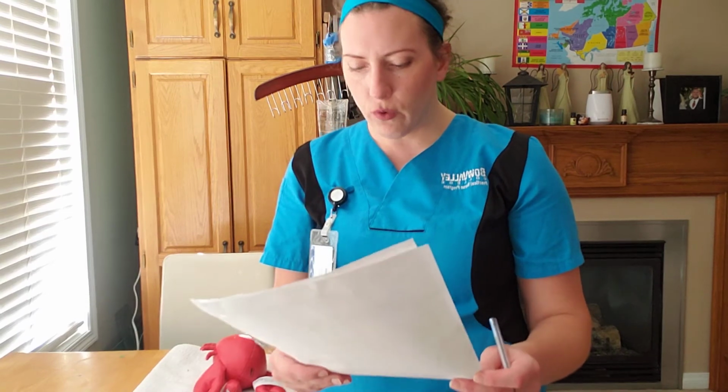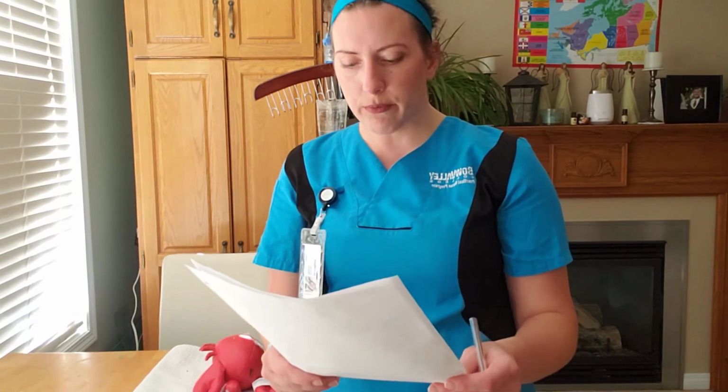So we're going to be looking for fluid to infuse, as well to dilute the medication in that fluid. We are looking for compatible in normal saline. So dilution for IV infusion is normal saline. This medication is available in a 25 milligram per milliliter dose in either 2 ml or a 50 ml vial. The stability for the vial is they should be stored at room temperature and protected from the light, and the infusions prepared on nursing unit should be used within 24 hours of application.